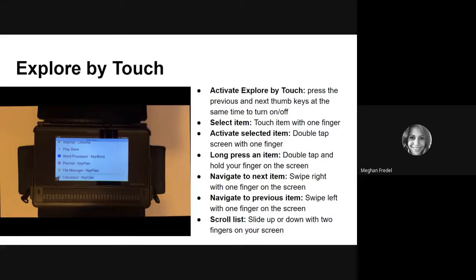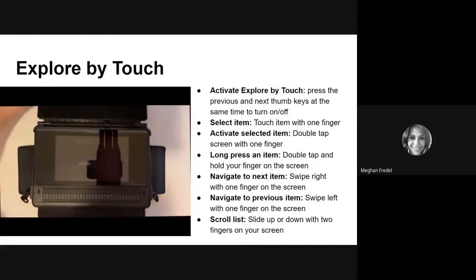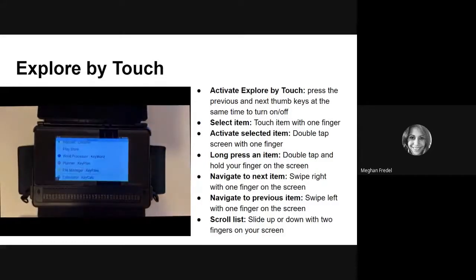So the BrailleNote Touch Plus has an Android system and an Android tablet in it. If you have your device in front of you, pop the lid open. If it's closed, there's a little tab on the left side that will help you easily lift it up. And then the screen will light up. So the Explore by Touch gestures, if you have an Android cell phone or tablet, you are likely very familiar with these gestures already.